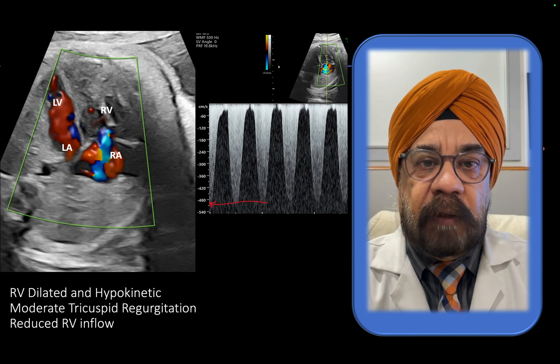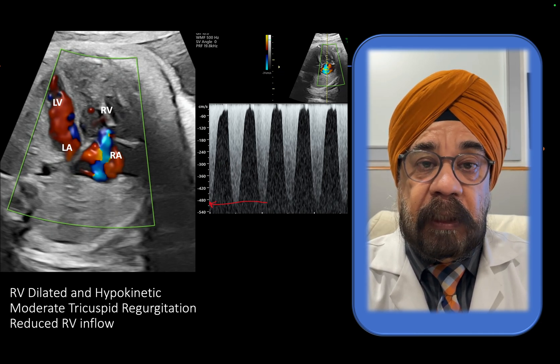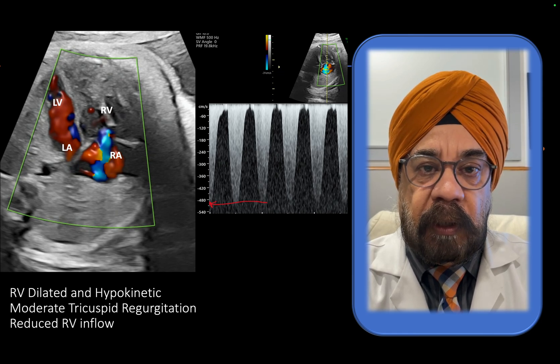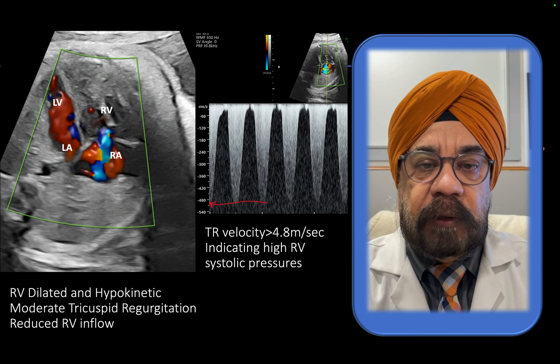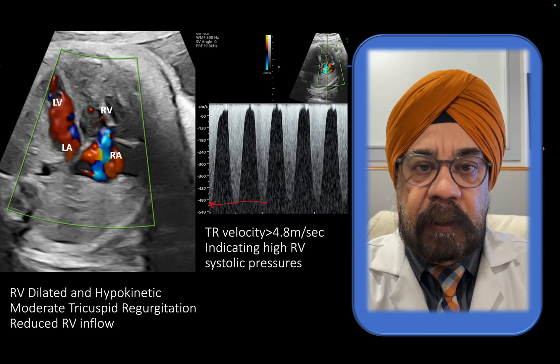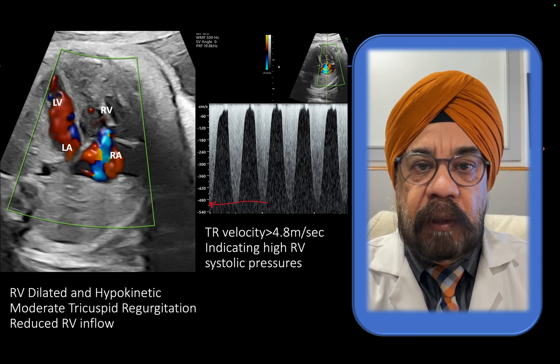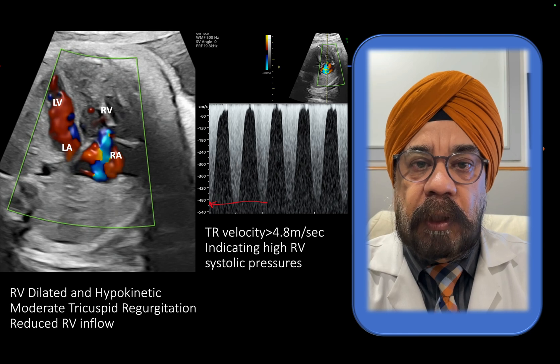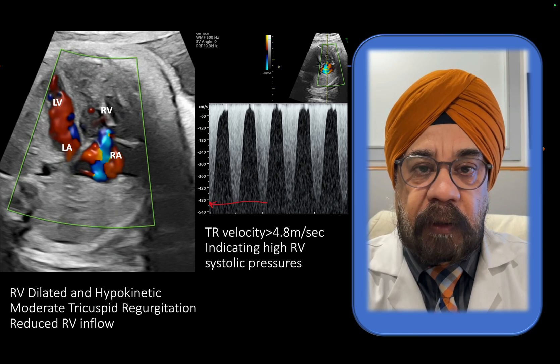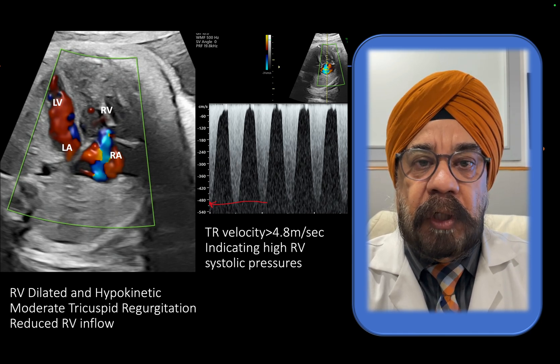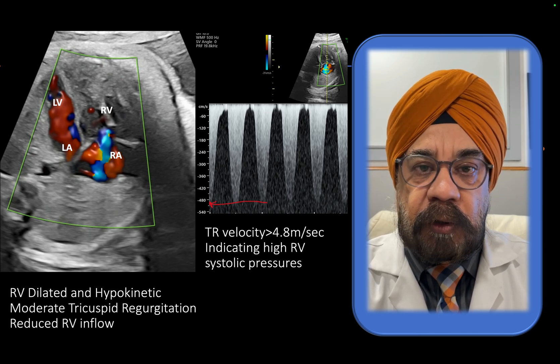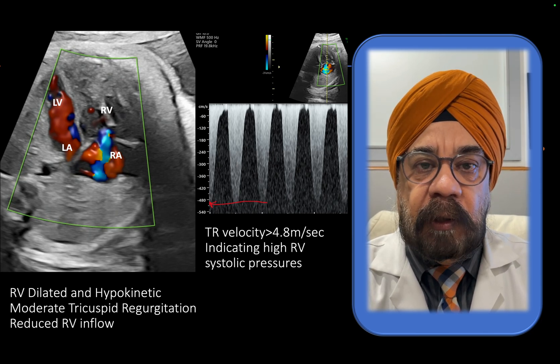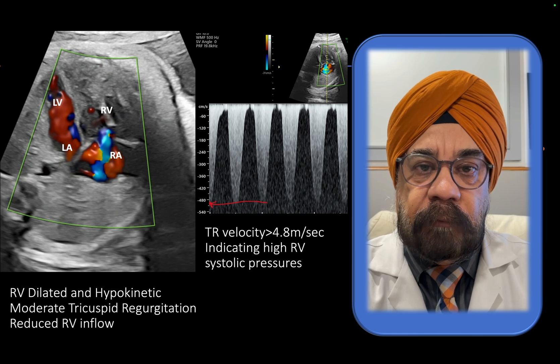Now we get the TR velocity, which is about five meters per second — a very high TR velocity for this gestational age of 30-plus weeks. If you have severe TR with high TR velocity, it indirectly indicates that RV systolic pressures are elevated. This rules out cardiomyopathy of the right ventricle. The RV is generating large systolic pressures, which indicates there is obstruction ahead of the right ventricle.